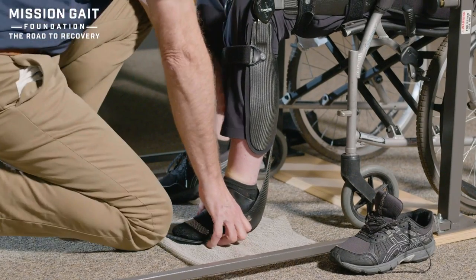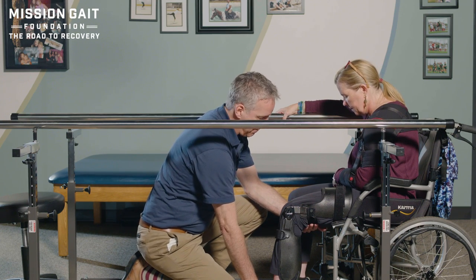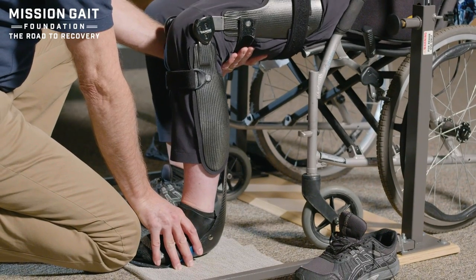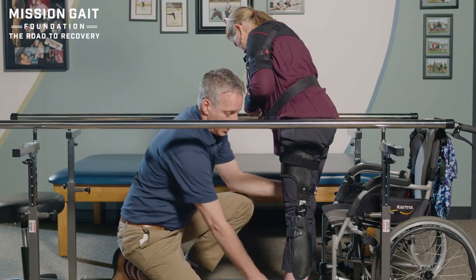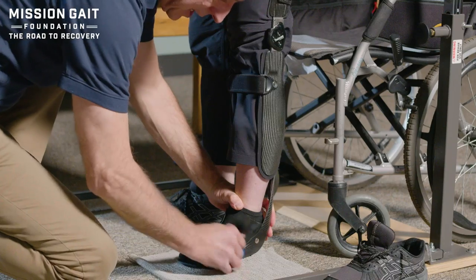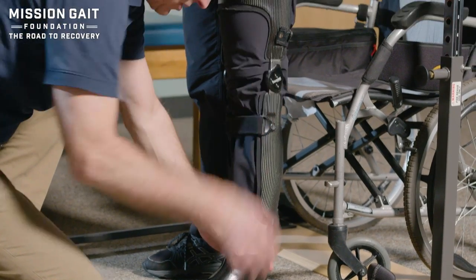I'm going to bring her back here and use my knee to help block. As a physical therapist, a lot of times you need more than two hands. Eleanor, I'm going to have you lean forward, go ahead and stand up like you normally do, and I'll stabilize this leg. This is going to feel very awkward for her because she's used to having a shoe on. Eleanor, shift your weight a little bit towards it. What I want to check for is where we're sitting in the brace — fitting in the boot correctly. Do I see any rub areas? Do I see any pressure problems? It doesn't look like it's going to cause irritation on the malleolus, medial or lateral. Making sure we have a pretty decent fit.